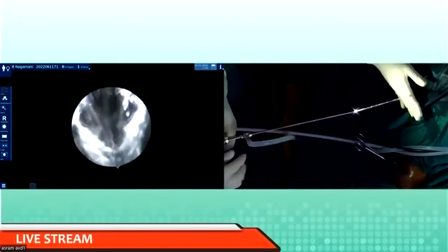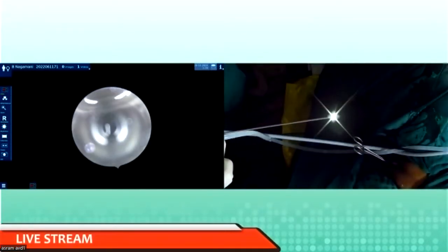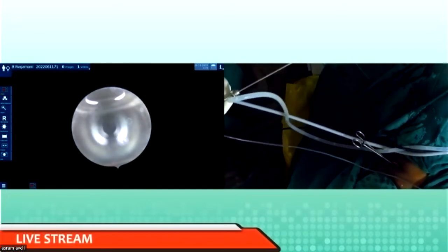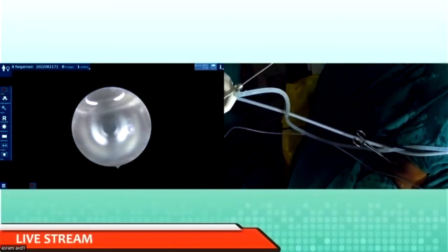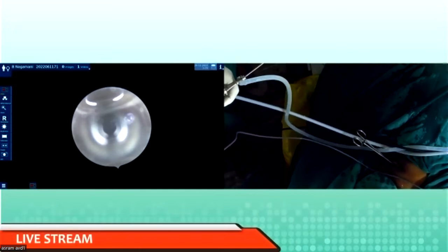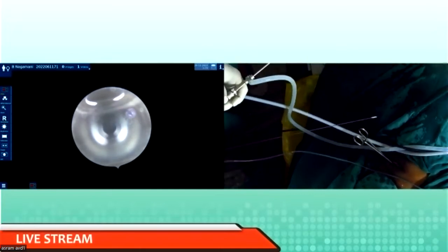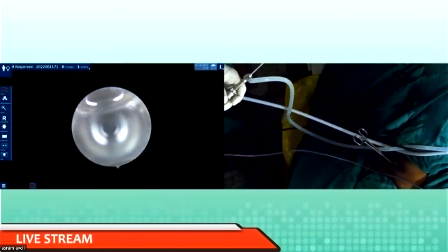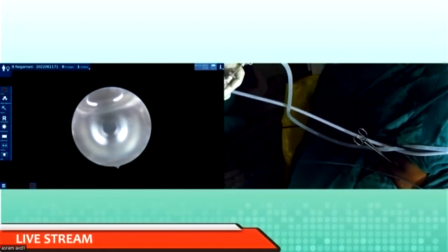There's no outflow. Because the irrigation channel has been occupied by this instrument. That is why the bore is less and the flow is less. So if you depend on that 150, you will end up having a collapsed cavity. So here you have to increase to 200. Here you will have practically 100 or 80. Correct. Now I showed you practically.